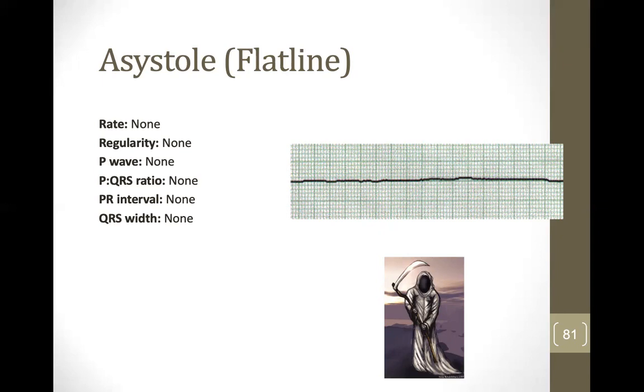So this is the number one falsity of media when it comes to the medical field, is that we often will portray it as if we would shock asystole or this flatline. And in fact, we do not do that. I wish that movies would no longer show that, because when me as a medic can show up on scene and we see this no electrical activity, I can't do anything. I can't shock it. And people don't understand that because it's such a misnomer out there because of just a lack of education. So just keeping this in mind, this is no electrical activity.